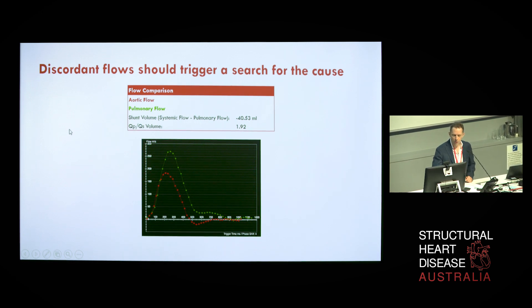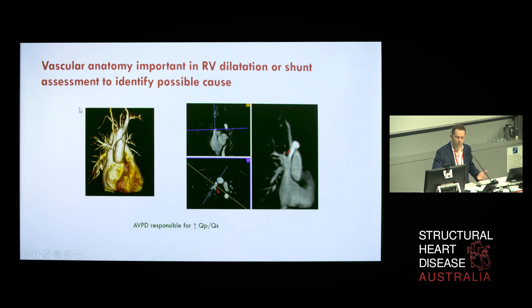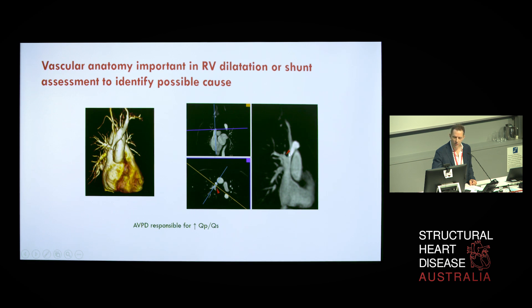Discordant flows should trigger a search for the cause. In this particular case, there's marked discordance between calculated aortic and pulmonary flow with a QP to QS of 1.92, in a patient with a previously dilated right ventricle on echo. Following gadolinium administration, a magnetic resonance angiogram revealed partial anomalous pulmonary venous drainage to the superior vena cava, appreciated on multi-plane reconstruction and in three dimensions. This demonstrates the power of the modality — we acquired all this information and answered the diagnostic question.